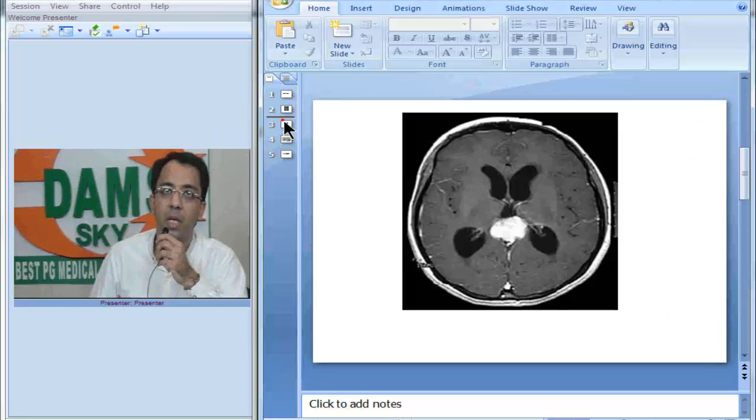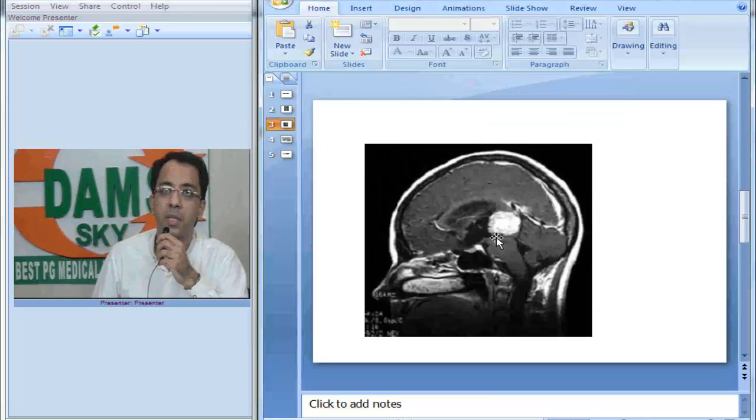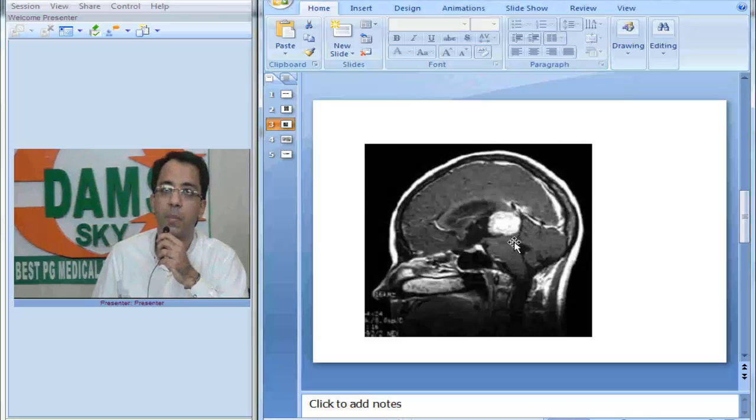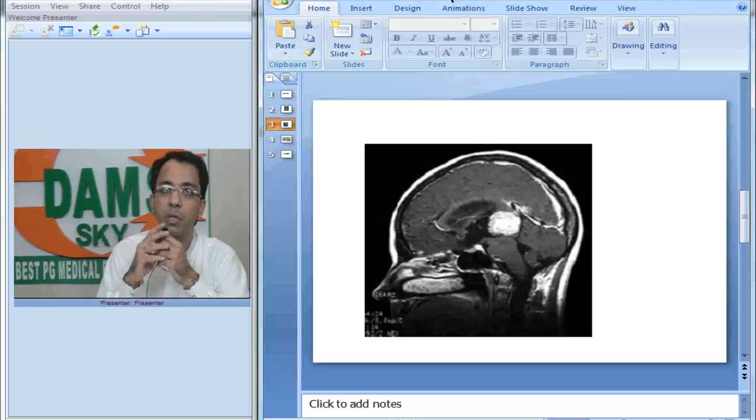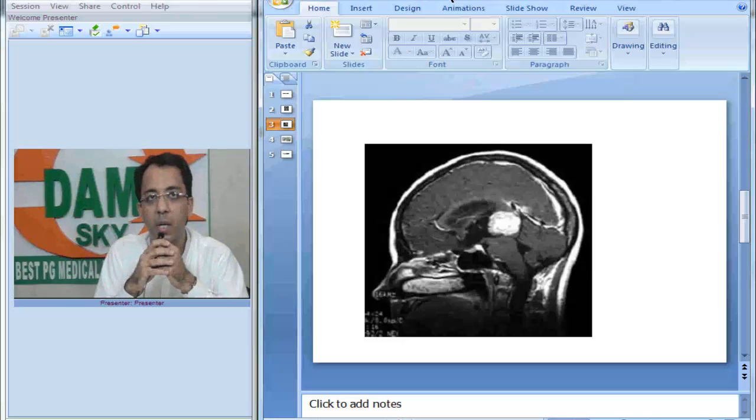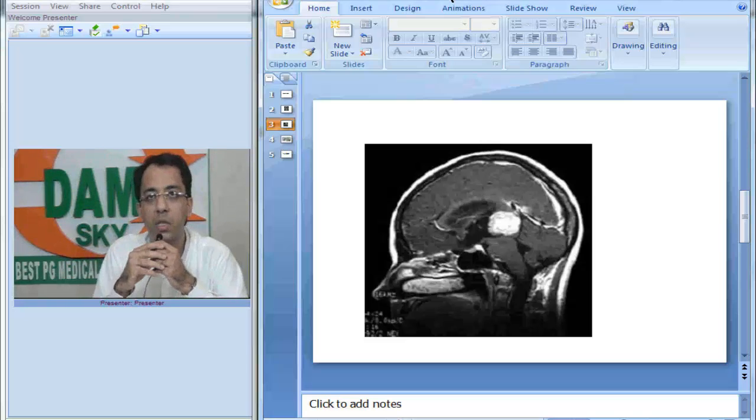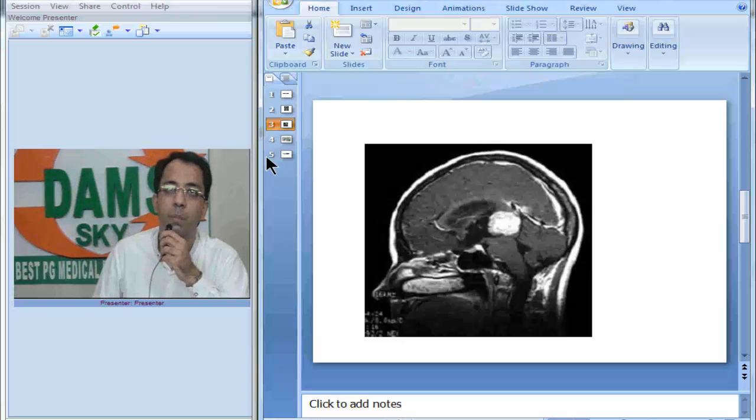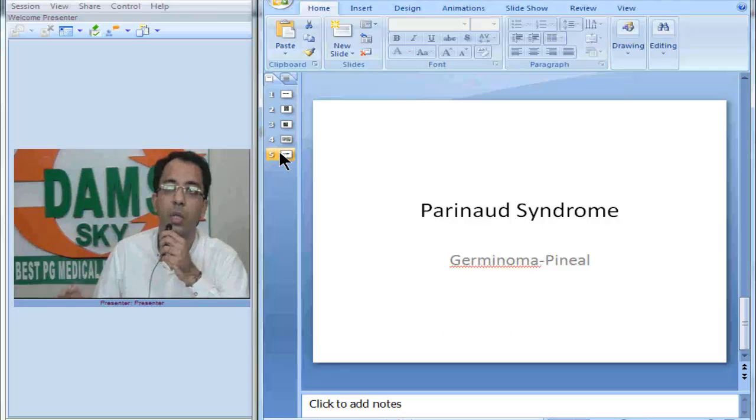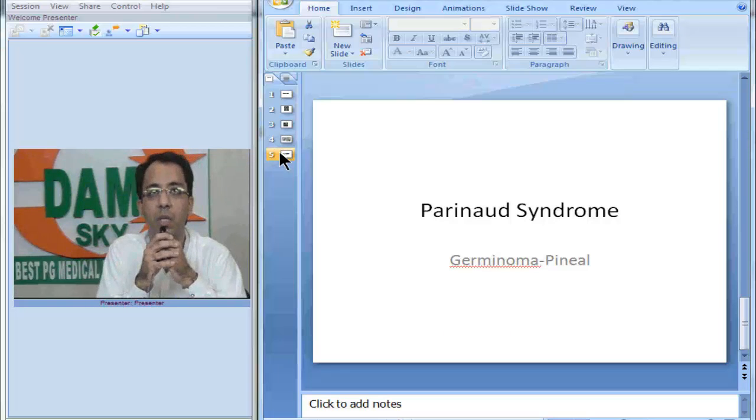Now think of it again and see the sagittal image. Now can you see the tumor compressing the tectal plate of the midbrain leading to upward gaze palsy? This is called Parinaud syndrome. This is germ cell tumor of the pineal area or the posterior third ventricle. Thank you.